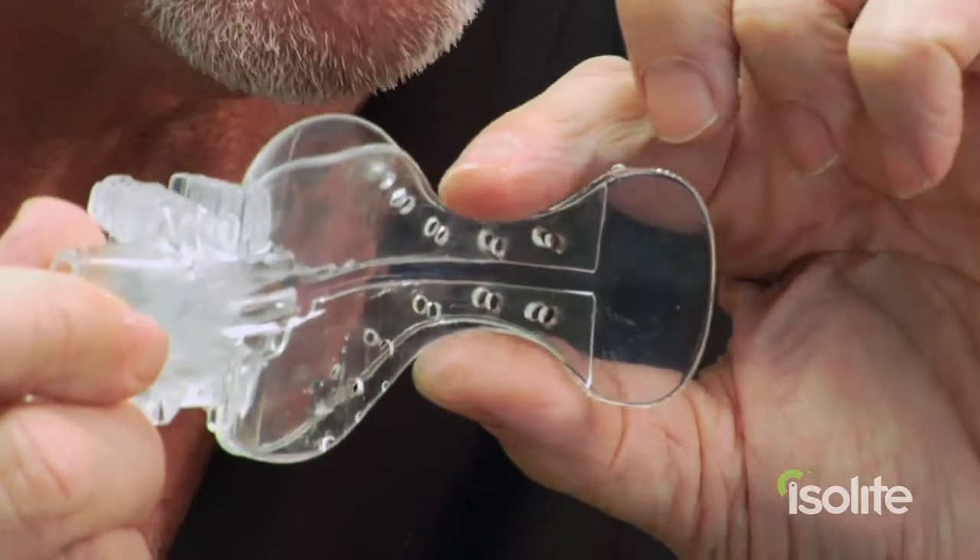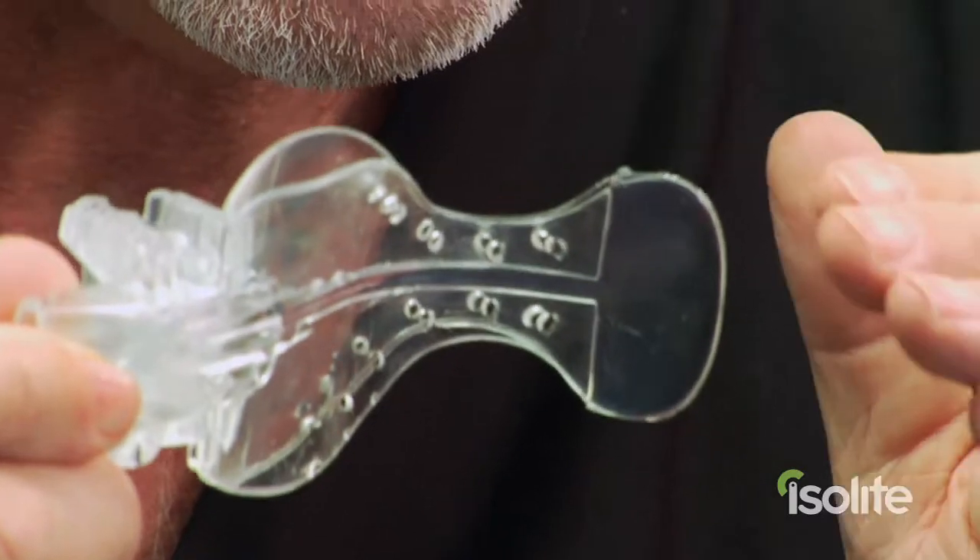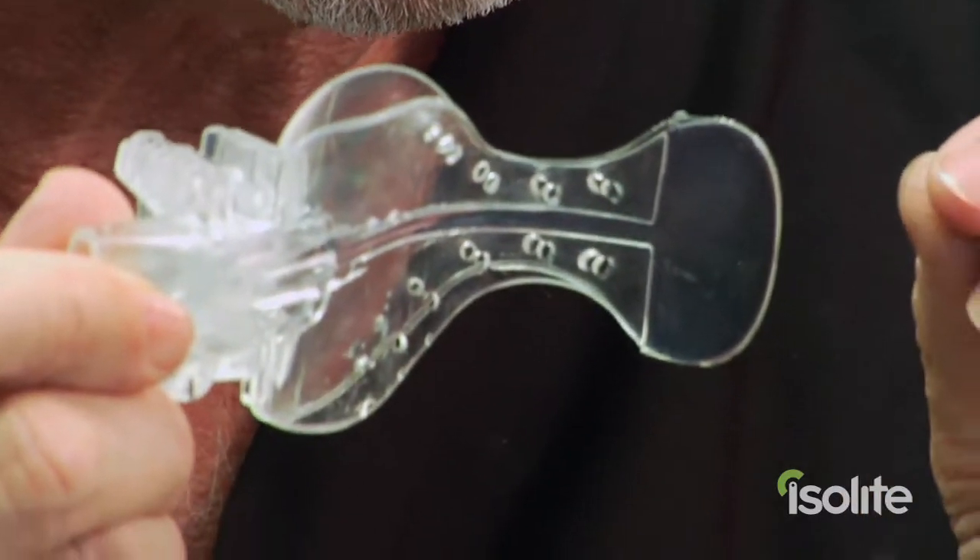The next part is what we call the isthmus — it's the narrow part. This isthmus becomes a throat protector, which goes back against the back portion of the throat and seals off the patient's throat, thus preventing any inadvertent droppage of material going down the back of the throat. The airway is still wide open so you can breathe very nicely — it's never compromised whatsoever.